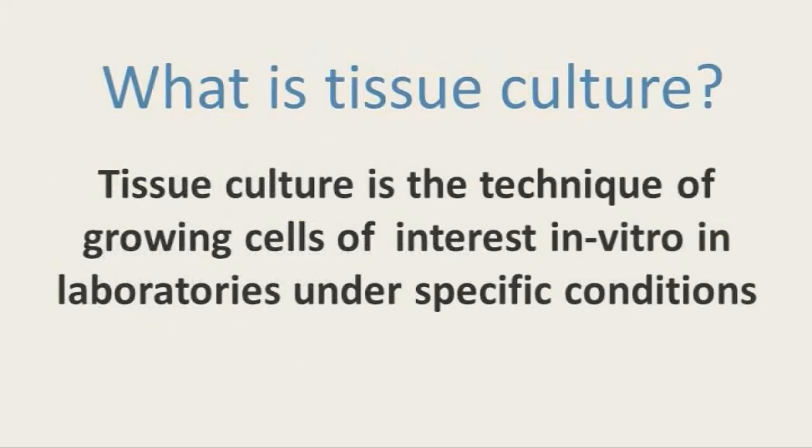What is tissue culture? In simple terms, it is a technique where cells of interest, for example fibroblasts, are grown in vitro outside the body or organism, under specific conditions which allow the cells to grow and divide. Tissue culture is sometimes referred to as cell culture.